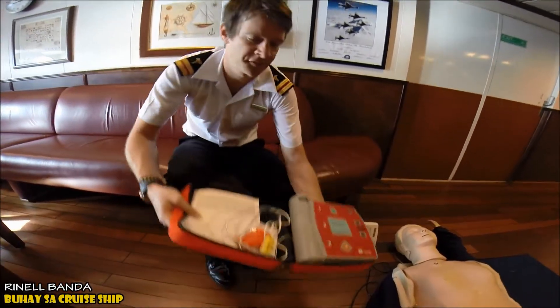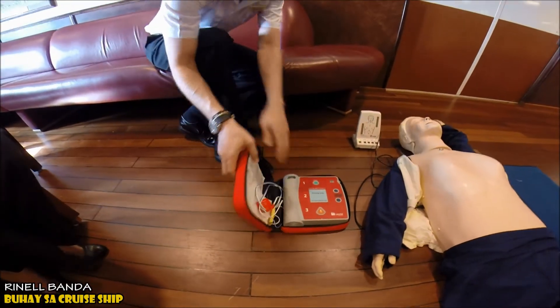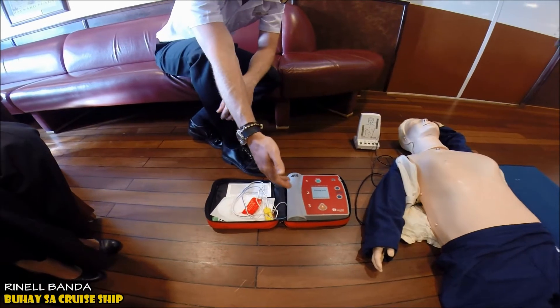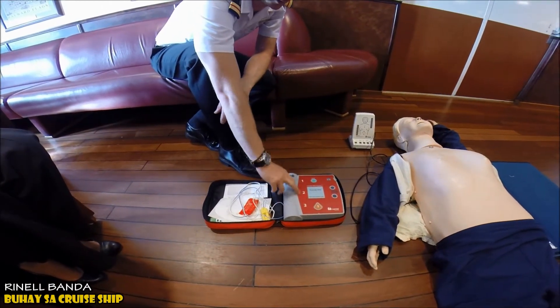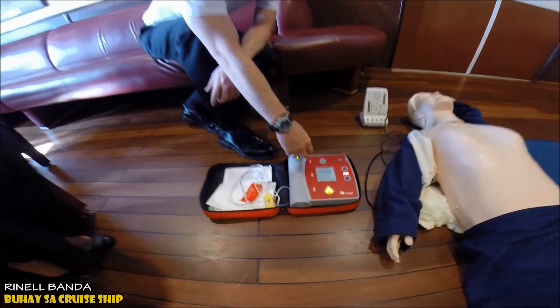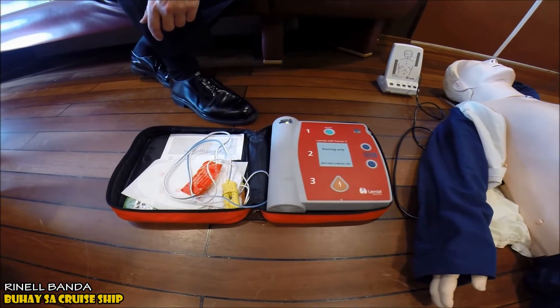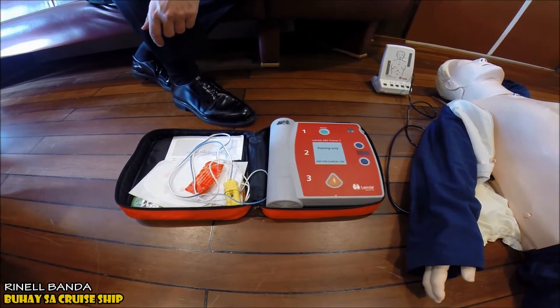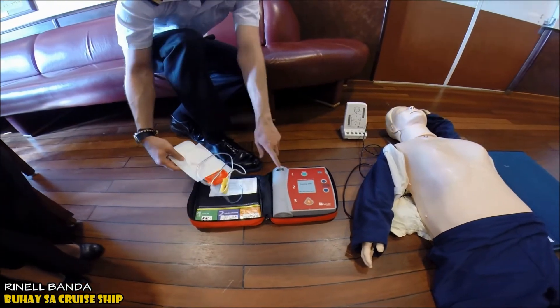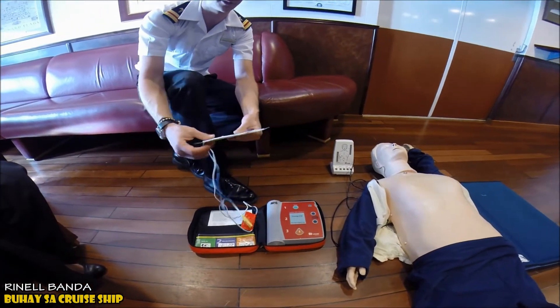All AEDs look the same. It's very simple — you open it up and it's all laid out. Step one, two, three. Number one: turn it on and then listen for directions. It directs you exactly what to do.